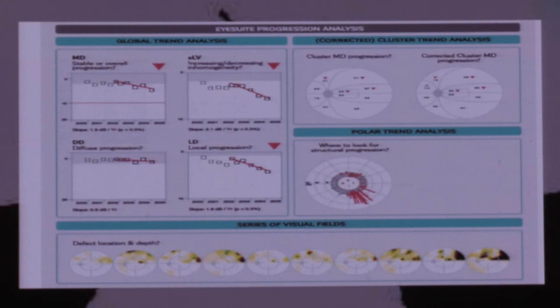Then you have the diffuse defect. In Humphreys, I really don't know much now, I have just forgotten that. You can see that this is the diffuse loss and this is the local loss. What you are really interested in is looking at the local loss, which is much more important for your glaucoma practice. So you can look at the local loss here, and you see where exactly is the loss happening in your visual fields, which area? Is it close to the disc? Most of the time, if you take a normal tension glaucoma patient, you can see the central area is getting more affected. If the central area is getting affected, then you can go much more aggressive in treating your patients, just simply because we all know that the central field is the most important one. If there is a progression in the central cluster, then you go for further treatment. Peripheral, okay, you can just be a little easy. But once you see the progression in the central area, this is called the cluster analysis, very important for us to understand this part of it.